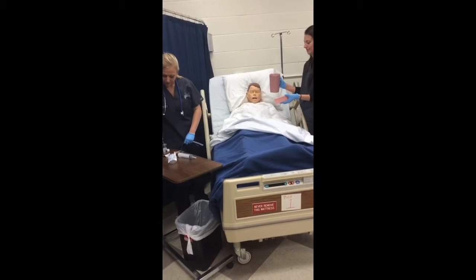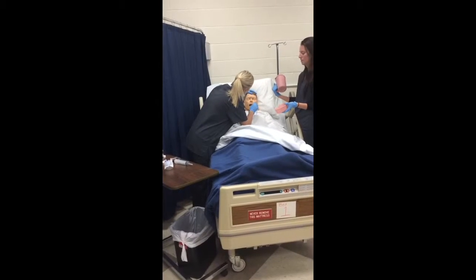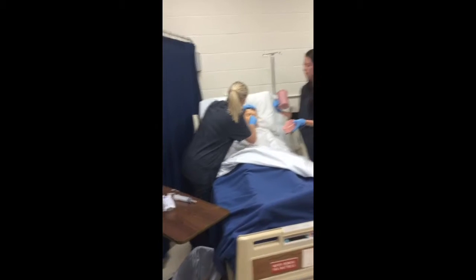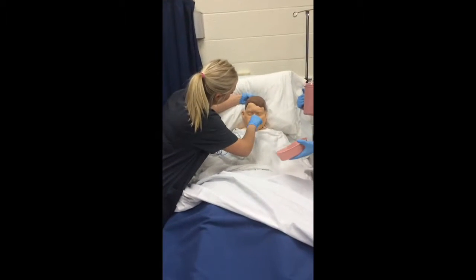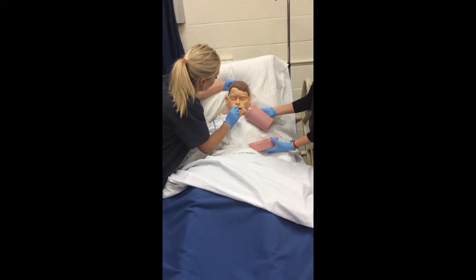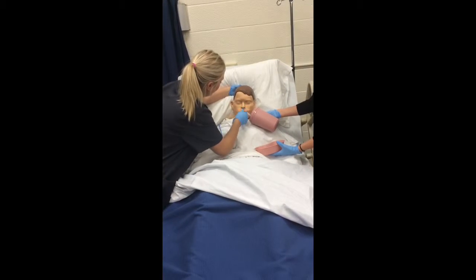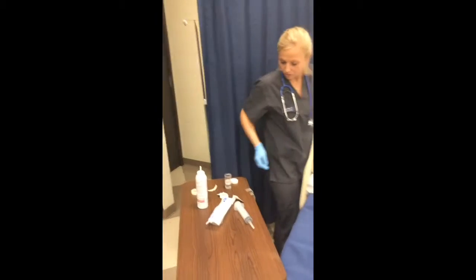Alright, at this point, we are going to lube it, have the patient hyperextend. We're going to insert it, and when we feel resistance or the patient starts to gag, we're going to turn it, have the patient tilt their head down, and encourage them to take drinks and swallow. With each swallow, we're going to further the tube in 2 to 4 inches until we meet the spot of our tape. We're going to hold it in place.